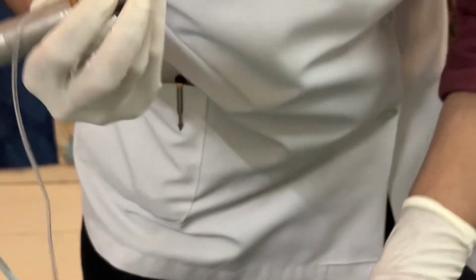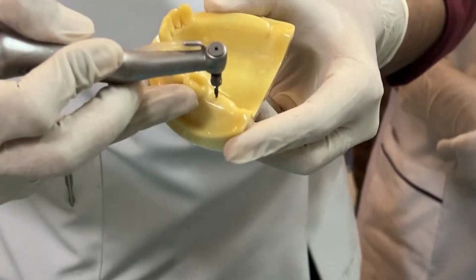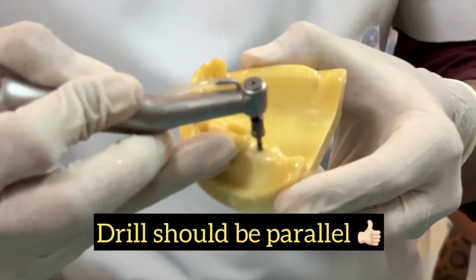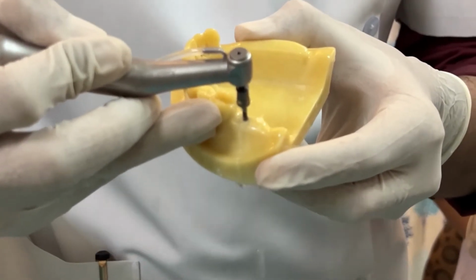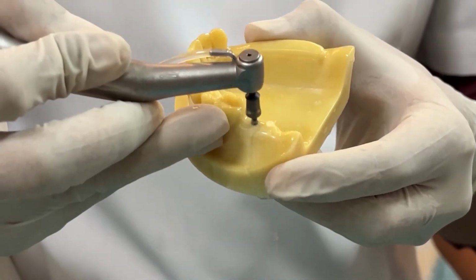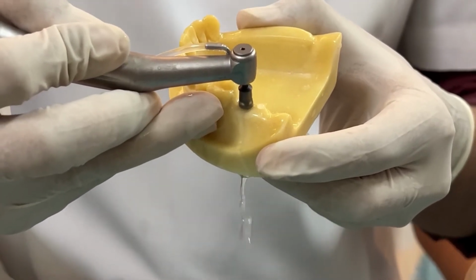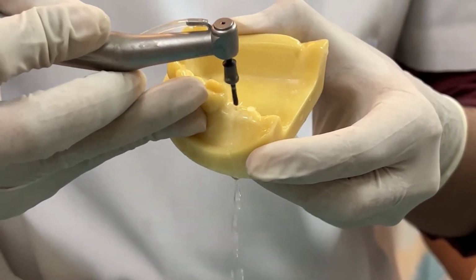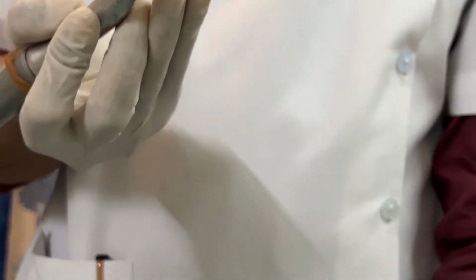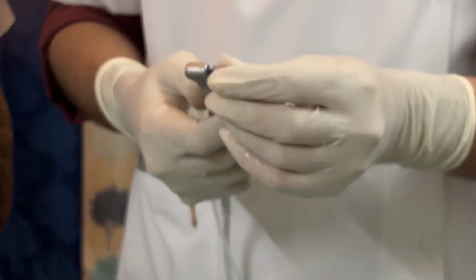Okay. So suppose I start with the osteotomy here. I'll have to twist it like this. Now keeping it parallel, slight pumping motion. Why slight pumping motion? Because ultimately we want the irrigant to reach the base of the osteotomy. And now I don't need to count. Straight away what has happened is the drill stopper stopped at the desired depth. So this is the main advantage of using a drill stopper.